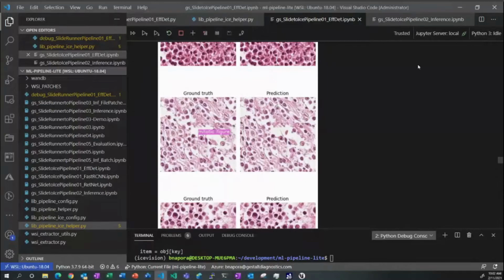We're missing them on the margins of the patch occasionally, and identifying some that aren't genuine. So it's transposing it into the actual whole slide image. Need to do some work in that area, but on the validation set itself, it's done pretty well.